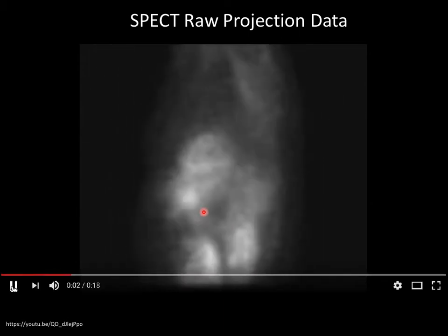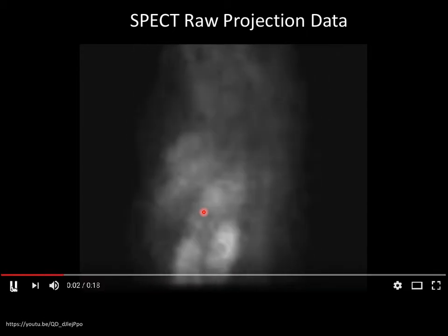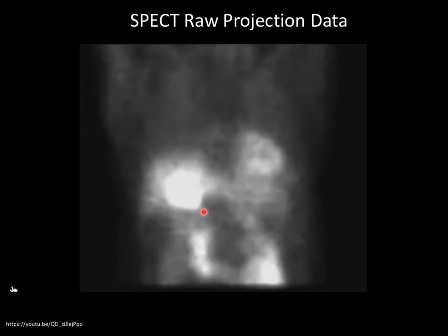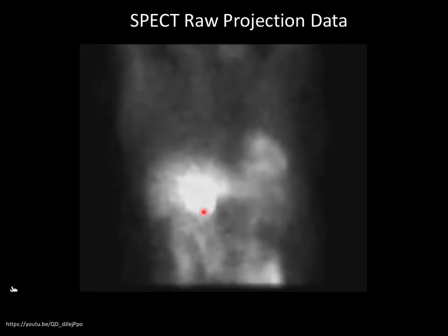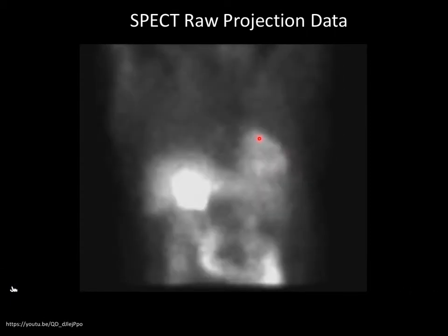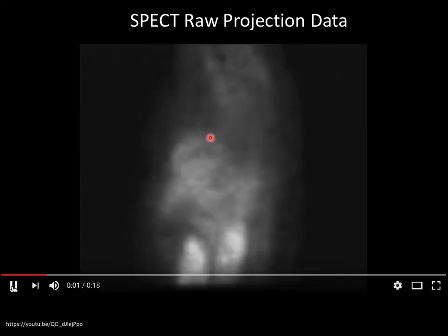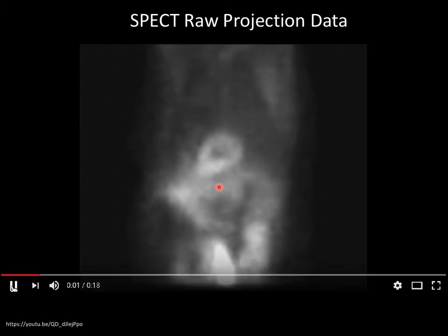So you can see where this contrast agent is taken up. It's taken up by all tissues. There's nothing here that's really completely black and not giving us a signal. That contrast agent went through the whole patient. But it did seem to accumulate in the myocardium, so we have more signal in the myocardium than other places.